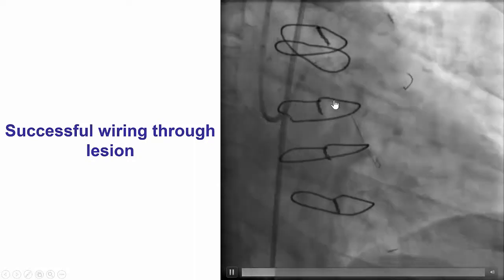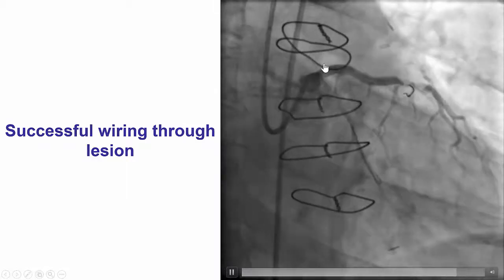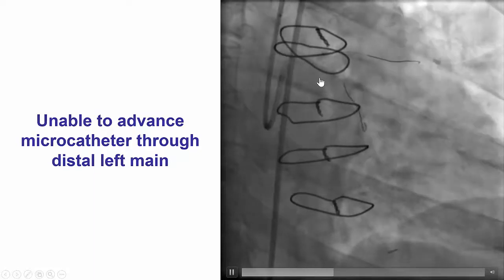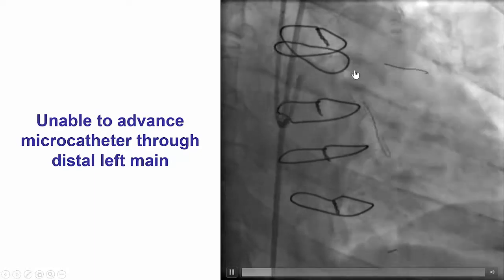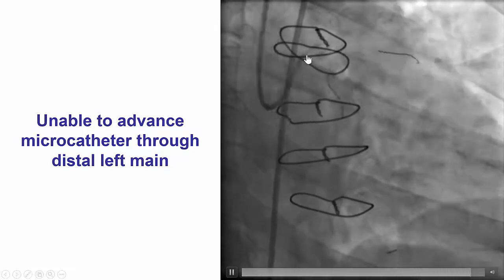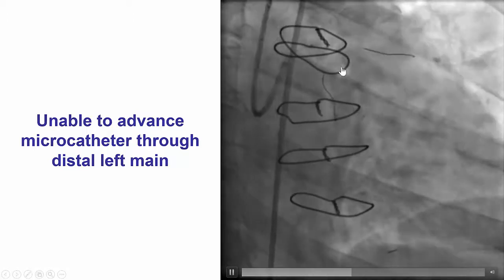We were able to subsequently advance the wire, which is now into the circumflex. However, the next step was to advance a microcatheter and change it for a soft guidewire. However, the microcatheter would not advance past the distal left main. The most likely explanation is that the wire had entered through the struts of the recently placed left main stent.